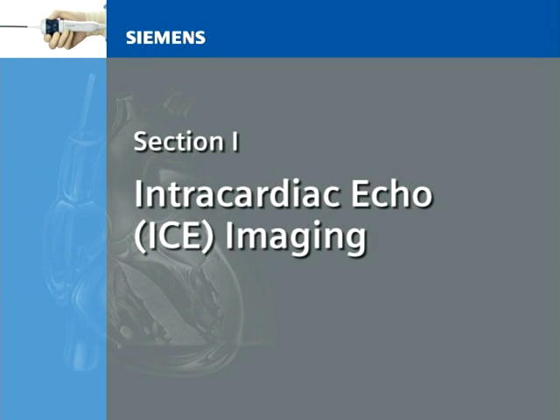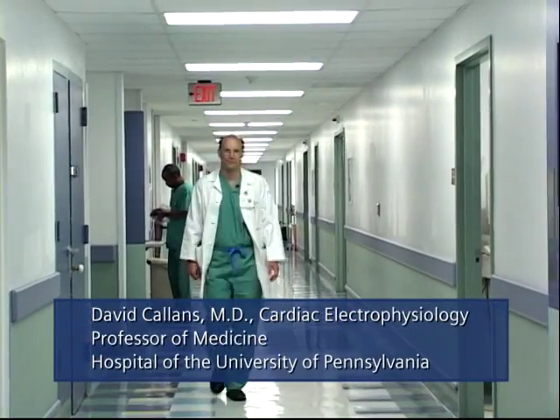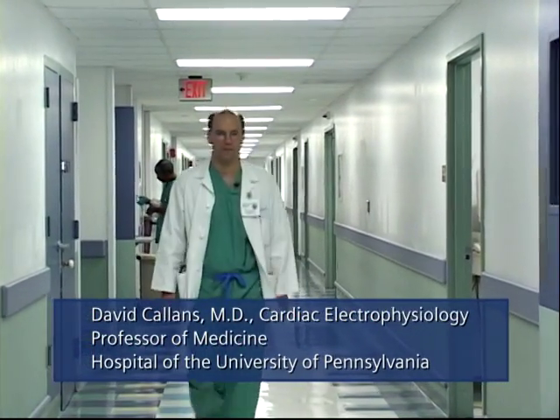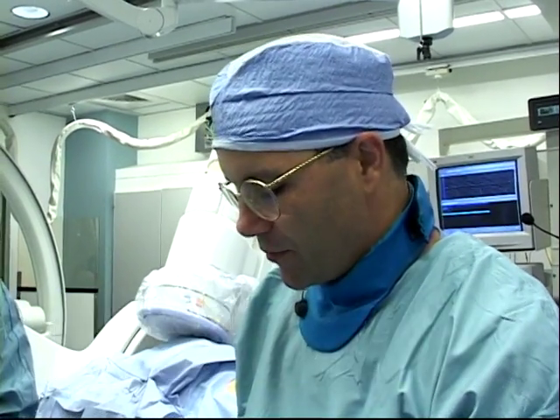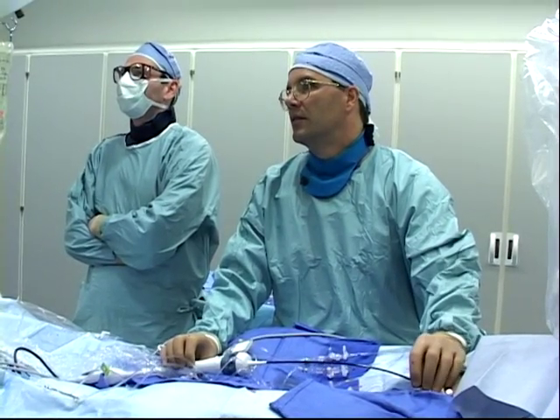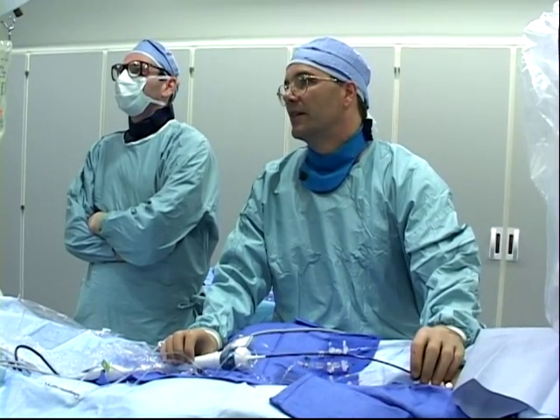Intracardiac echo imaging. Dr. David Callans is a professor of medicine at the University of Pennsylvania School of Medicine and a proctor for the AccuNav Catheter Peer Training Program. He will guide you through the intracardiac echocardiography imaging targets appropriate for arrhythmia ablation procedures.